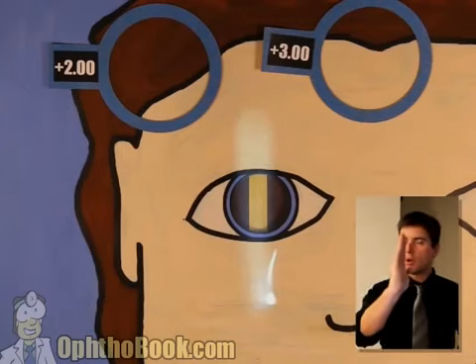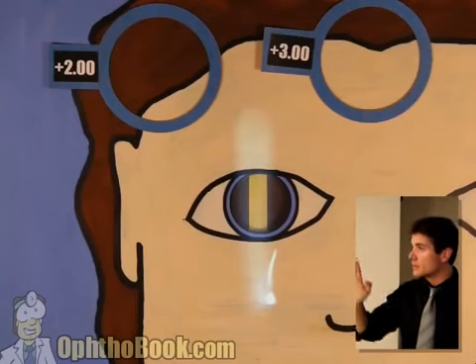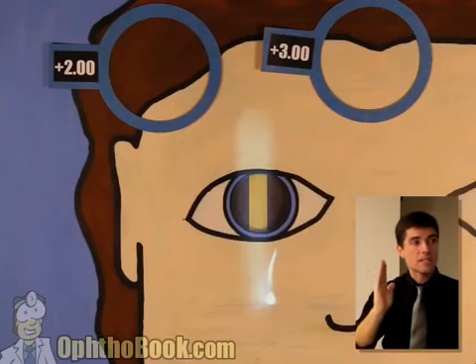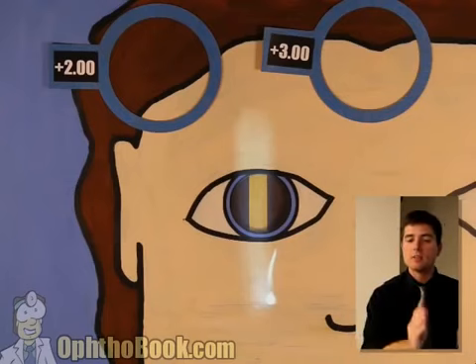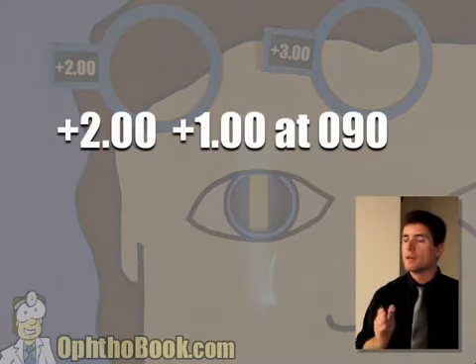And if you're not sure, hold your light beam up to the phoropter and look at the little angular degrees on there and make sure it's lined up with 90. And that's how I remember it. I don't try to think I was moving left and right, but the axis is always 90 degrees off the power. It'll confuse you. Just put these lenses aside, and at the very end, look at it. This is a +2 +1 at 90. So we write it out. A +2 +1 at 90.